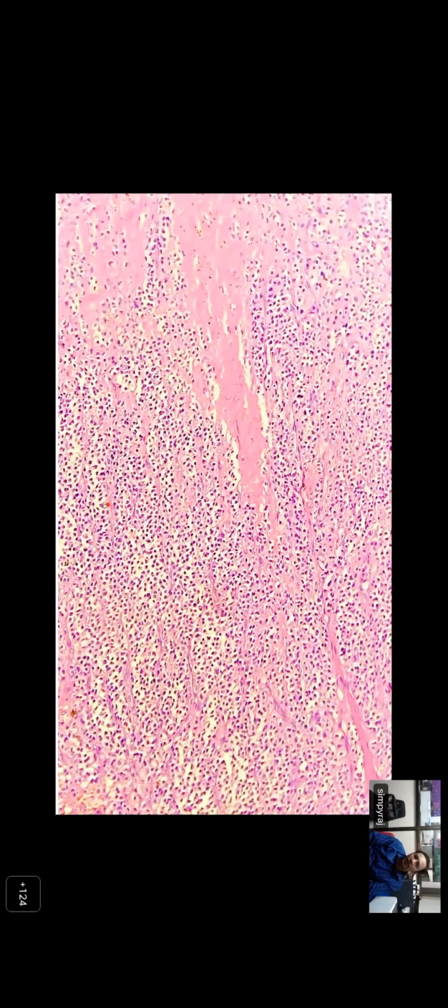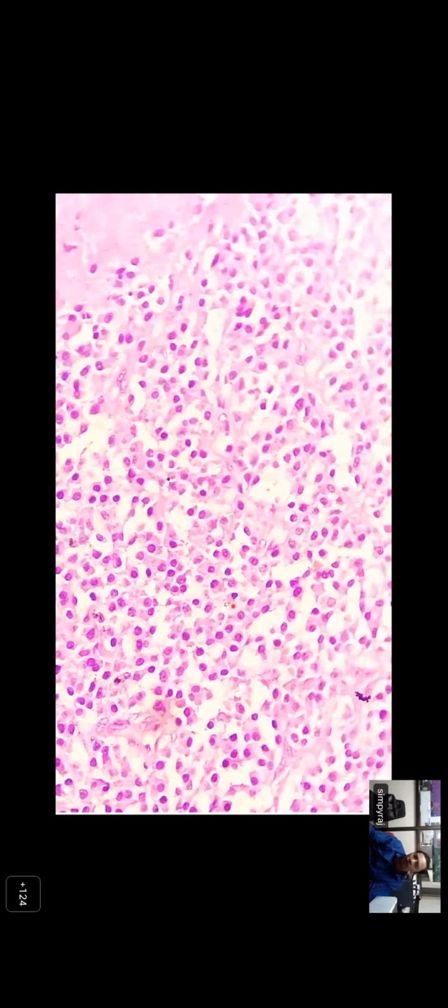Right. So the biopsy was done, and this is the biopsy. You can see the sheets of cells which are round. Let's see a closer look. If you look clearly, they are all plasma cells or plasmacytoid cells, because there can be other things which can look like plasma cells, but there are sheets of plasmacytoid cells, with abundant eosinophilic cytoplasm here. And so to confirm, IHC was done.